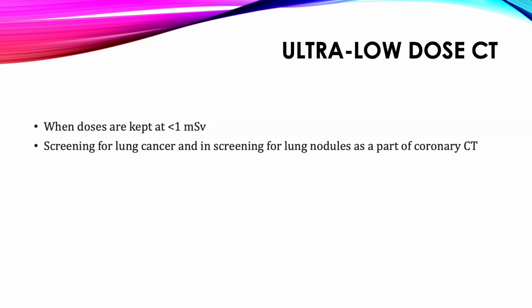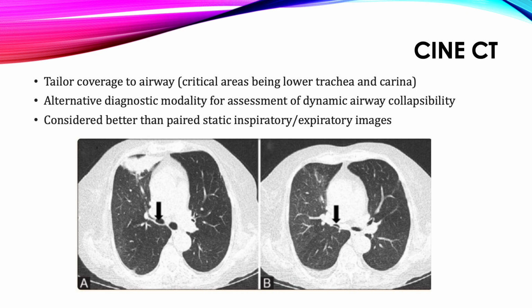How about an ultra-low-dose CT? It reduces the radiation exposure further, to less than 1 millisievert, and it can also be used for screening of lung cancer.